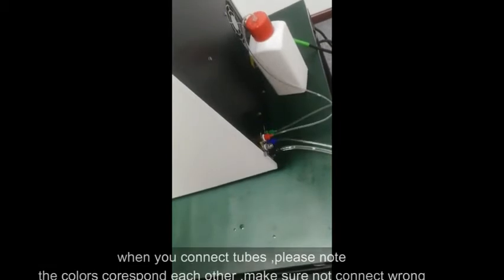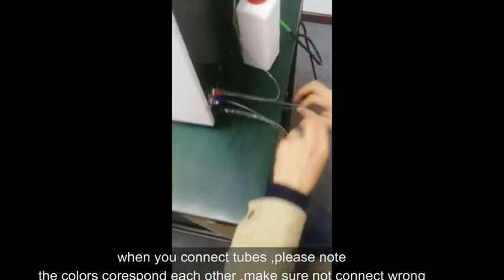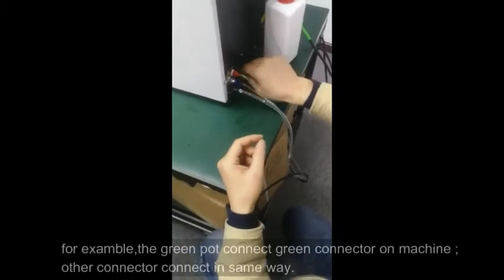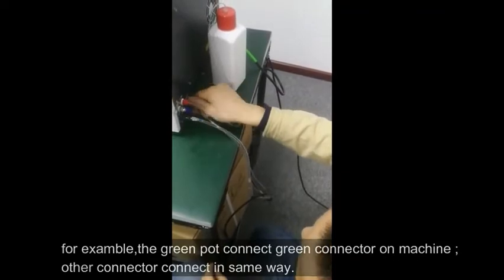Step 1: Connect Tubes. When you connect tubes, please note the colors correspond to each other — make sure not to connect them wrong. For example, the green port connects to the green connector on the machine. Other connectors connect in the same way.